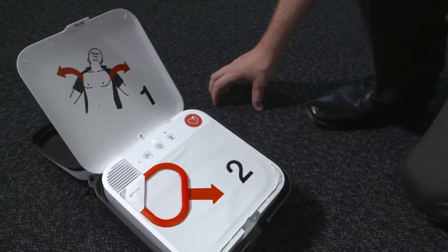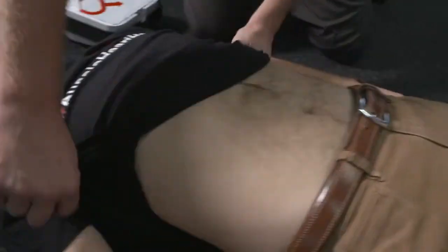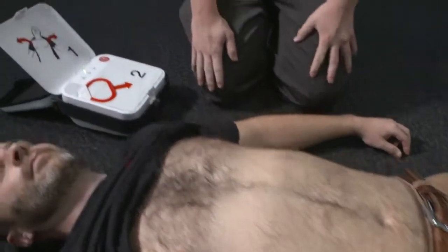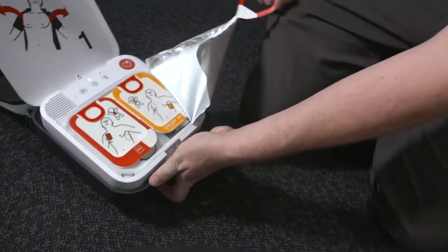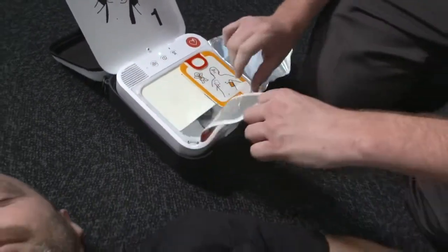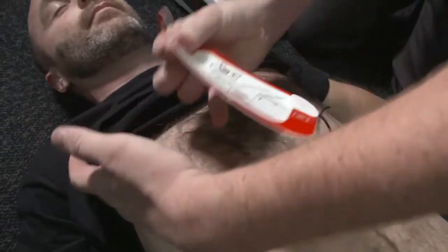Adult mode. Remove all clothing from patient's chest. Pull red handle to reveal pads. Look at pictures on pads. Apply pads to bare skin exactly as shown in the pictures. Press pads firmly.